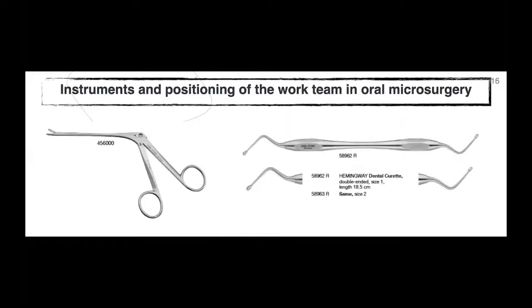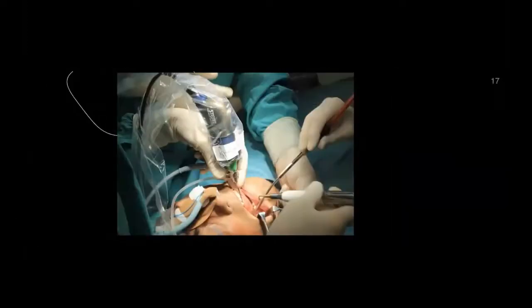Here, we can appreciate the entrance position of the endoscope, in this case an endoscope of 2.7 millimeter in diameter, in order to allow an occlusal perspective of a minimally invasive access for the removal of a right inferior molar in this patient.